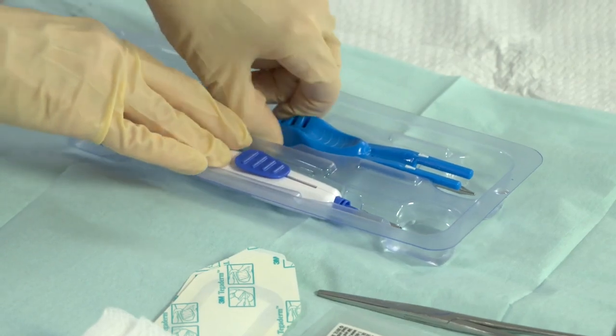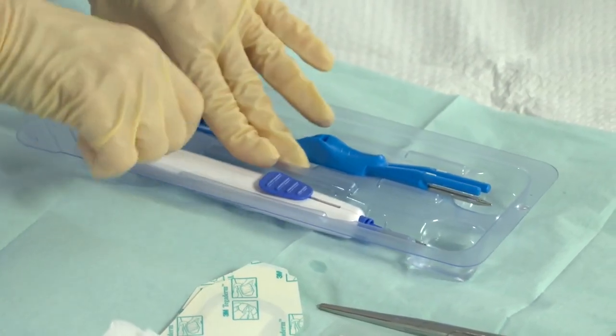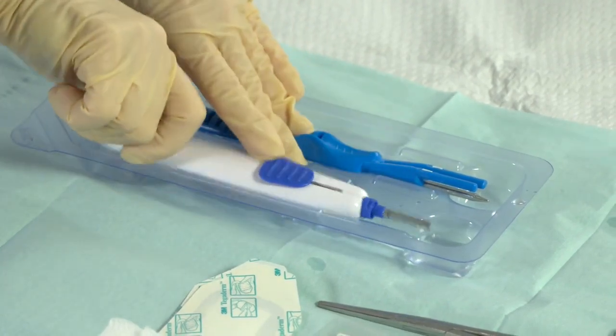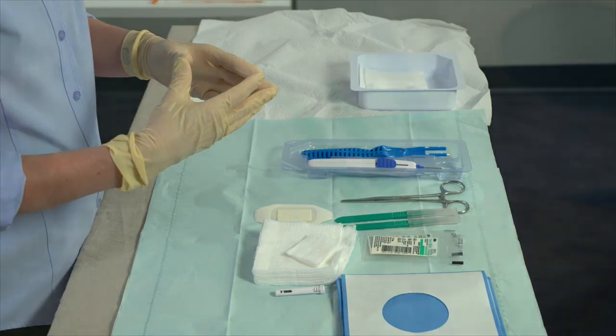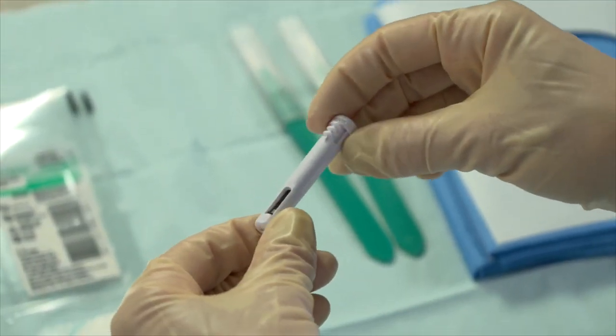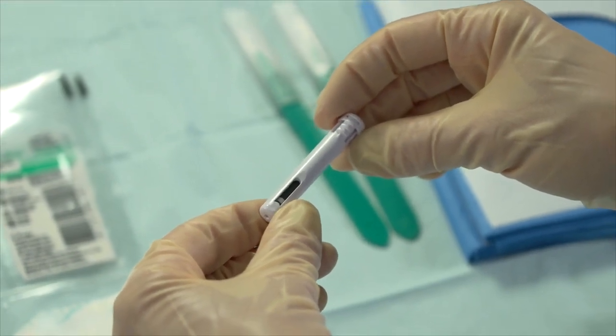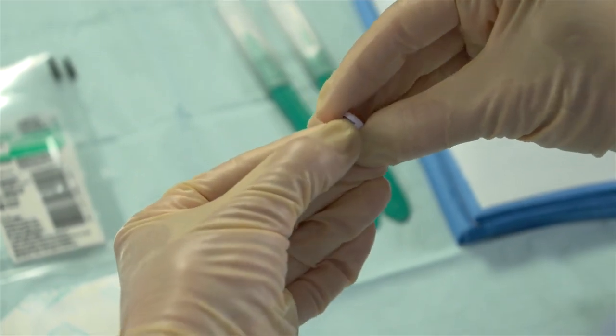Release the handles of the tools from the tray, and if necessary, reorient the tool tray to make it easier for you to grasp the tools during the procedure. Now prepare to load the sensor into the insertion tool. To do this, pick up the sensor holder and squeeze the ridged portion with one hand. With your other hand, pull to remove the holder's cap.